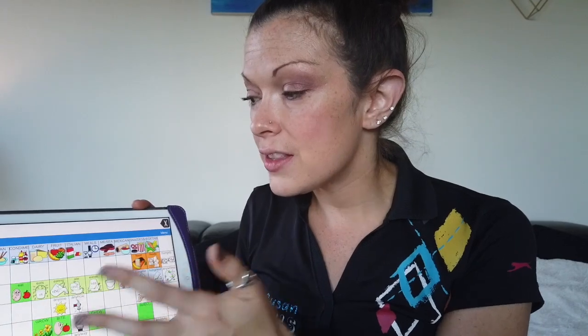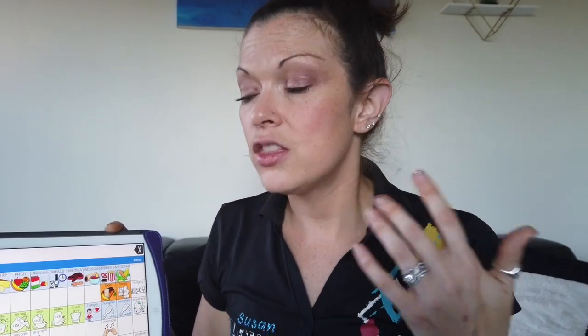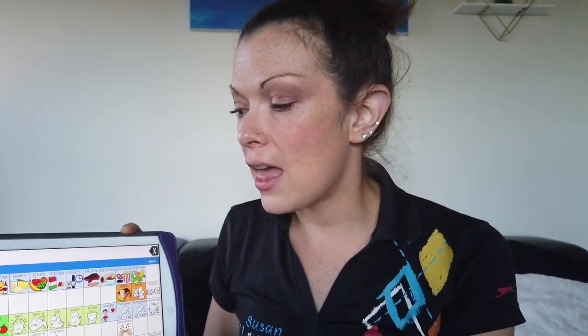It's important that we keep this in mind while we're teaching our children how to use a speech generating device. And we avoid using directions such as find apple, push the apple. Because now they're just learning to find that picture, just like they do in some receptive language tasks. They're just learning to push that button. Find eat. That's a one-step command.